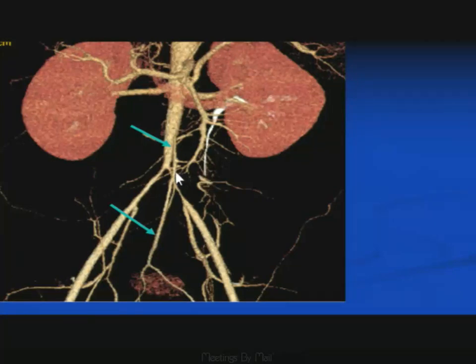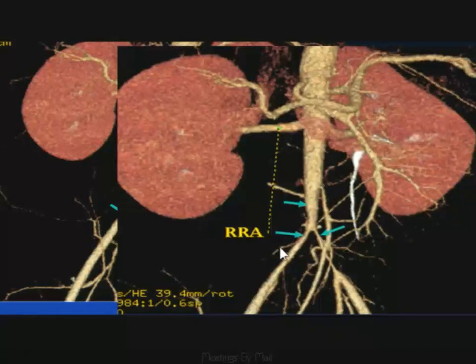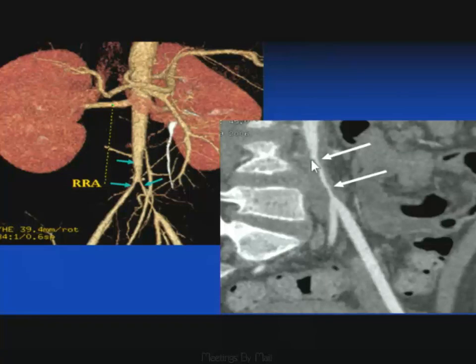It was a young boy under the age of 10. And he's got narrowings of his common iliac artery on the right and the left, particularly on the left. Here we are again, both common iliacs. And here's the curved plane reformation showing you that very narrow vessel. And there was soft tissue thickening around this. And this is a case of Takayasu's, which is very uncommon in a young pediatric patient, who subsequently developed Takayasu's in his subclavian artery.